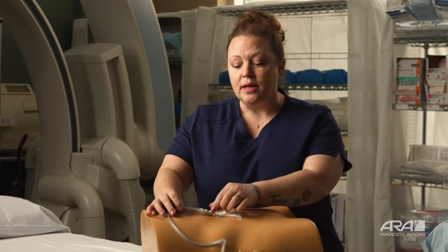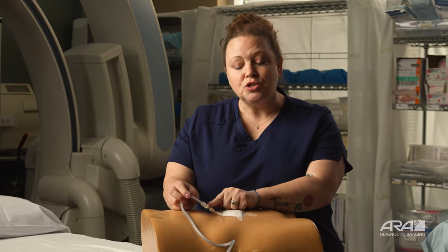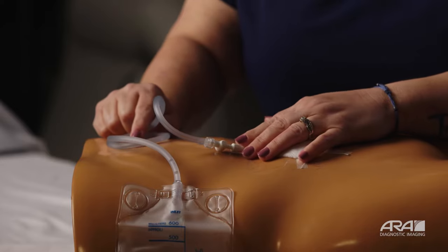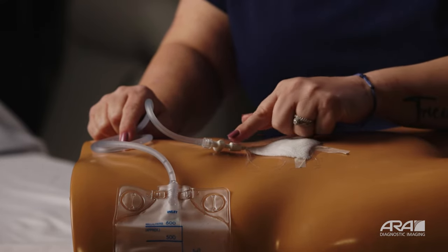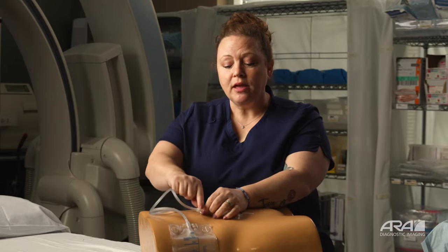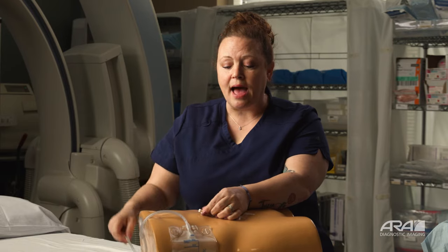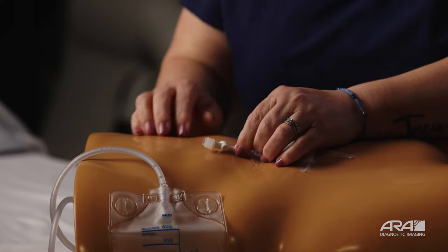Your equipment may look slightly different. The important thing to know is that where your catheter tubing connects to your drain will always be the same. Your biliary drain may be connected to catheter tubing so that your drain can drain directly into a bag. You may have come home from the hospital with a small cap placed over your biliary drain so that it does not drain freely into the bag.